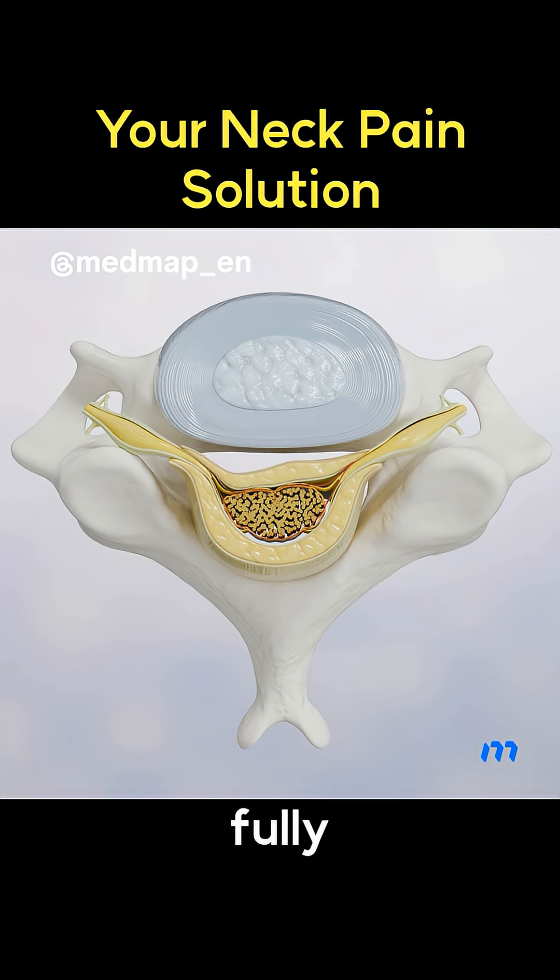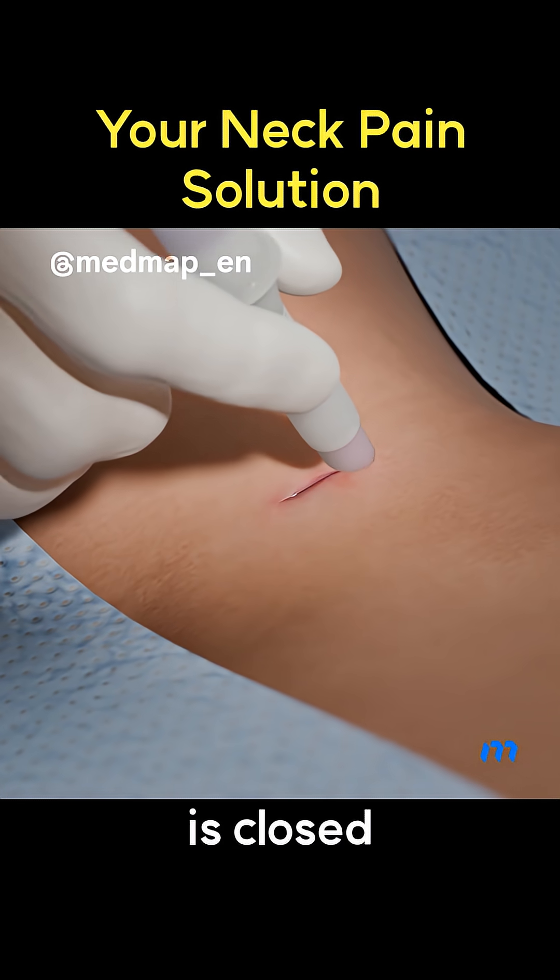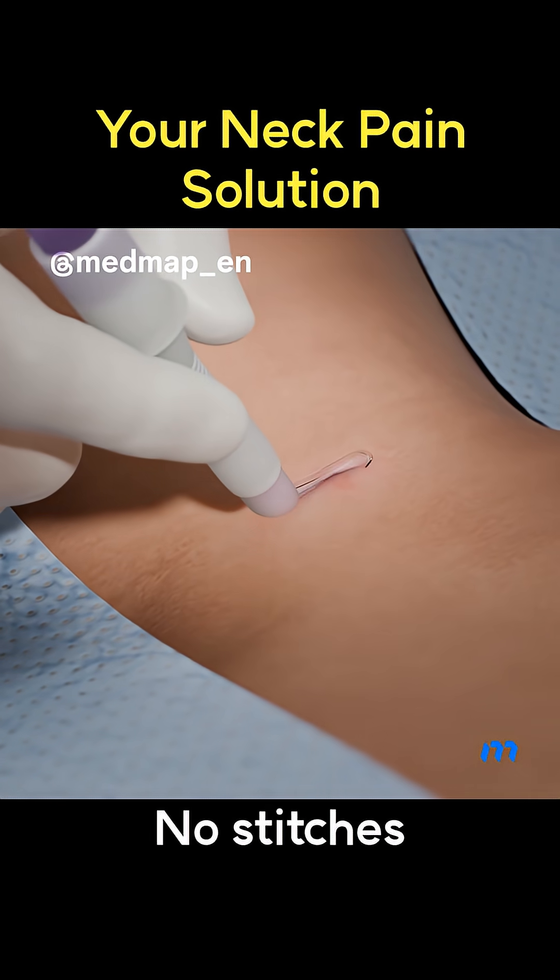After confirming the nerve is fully decompressed, the endoscope comes out, and the tiny skin opening is closed with medical glue. No stitches needed.